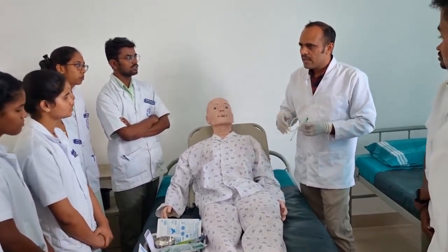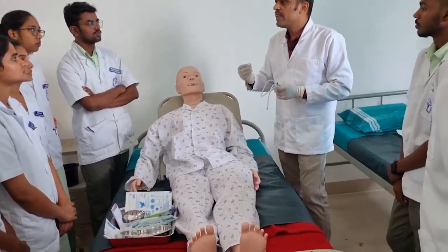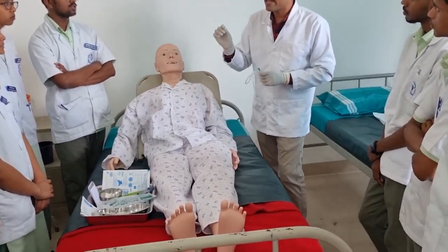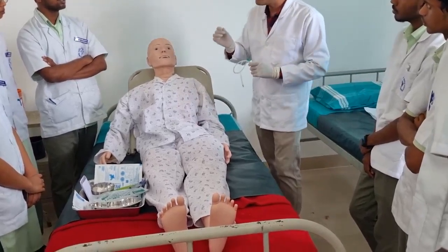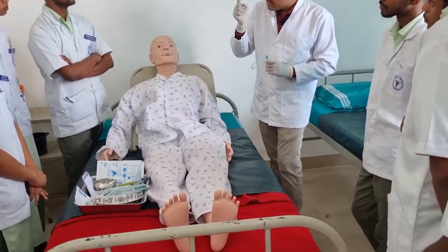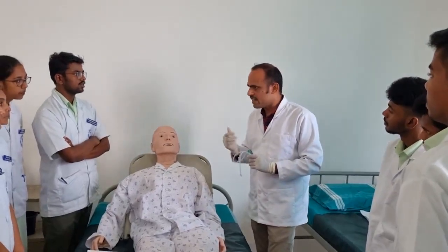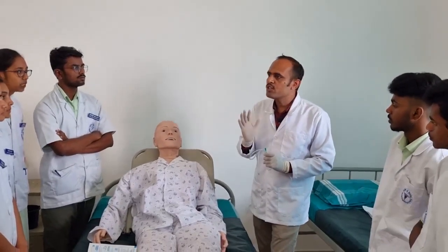Okay, each of the NG tubes will have a different color. For example, 14 French carries a green color, and orange means it is 16 French. Usually green color we will use for children, and orange color we will use for adults. Okay, that is the information regarding the NG tube.